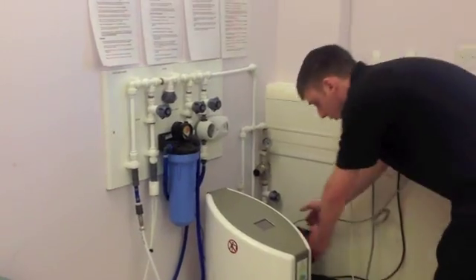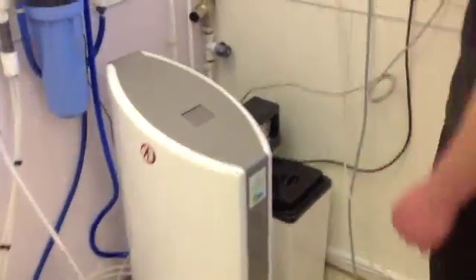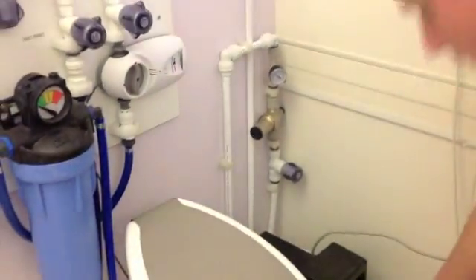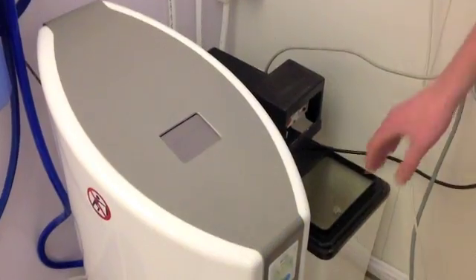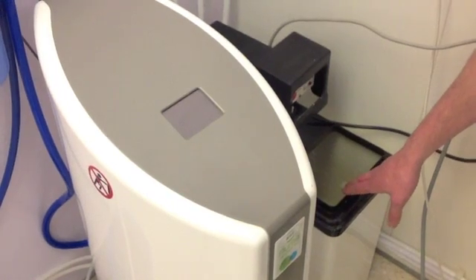Now your water softener only needs to be turned on and plugged in when you are actually regenerating it. The regenerating takes 2 hours for a white softener and an hour for the silver softeners.